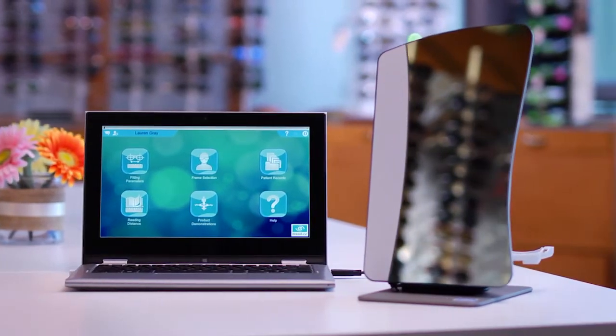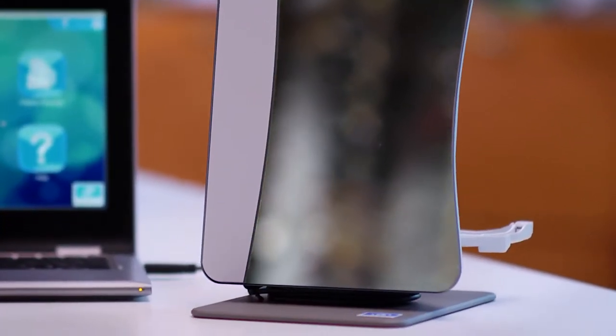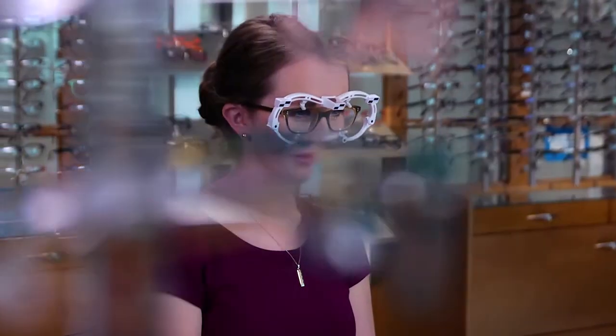Welcome to the MyFit system. By following these simple steps for doing a customized fitting, you'll guarantee your patients receive eyeglasses that fit them perfectly. Let's get started.